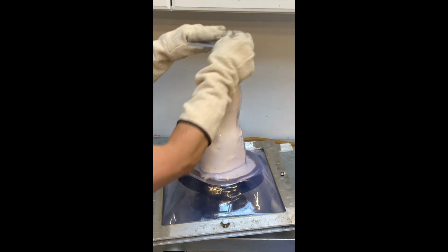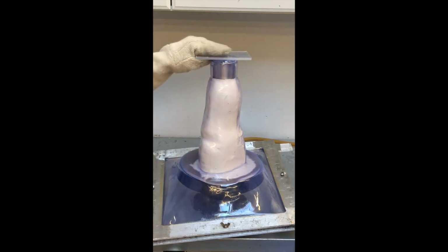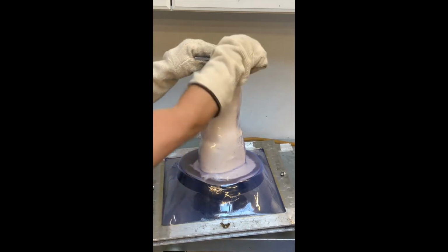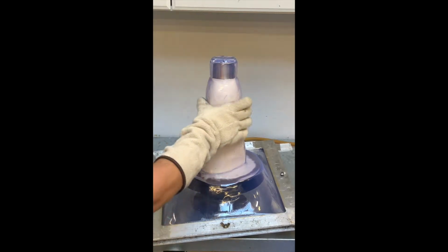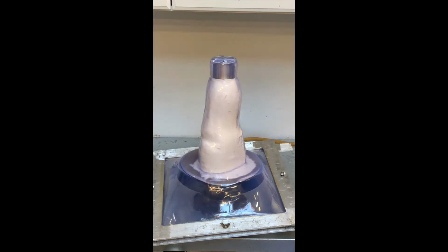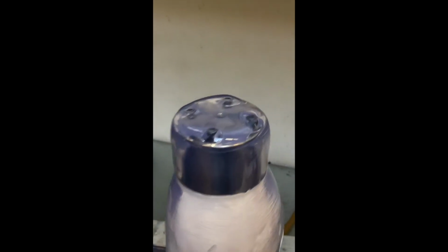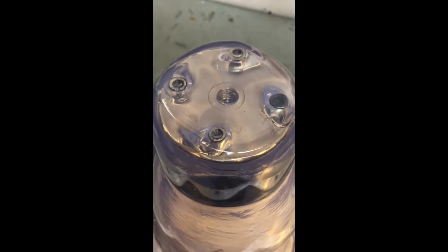Use a flat piece of plastic and firmly press down on the cap screws on the distal end of the socket. This will force the plastic to conform around the screws. There cannot be any webbing of the plastic around the screws, as this results in a much larger hole diameter in the end of the socket. Ensure that the plastic does not bridge from the edge of the cap screw to the base of the molding dummy.